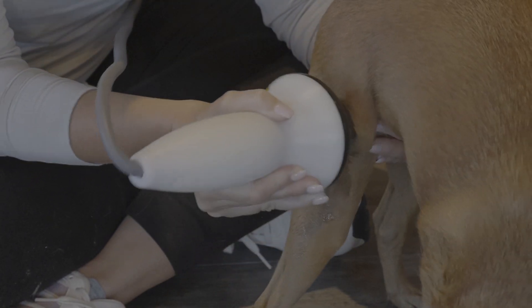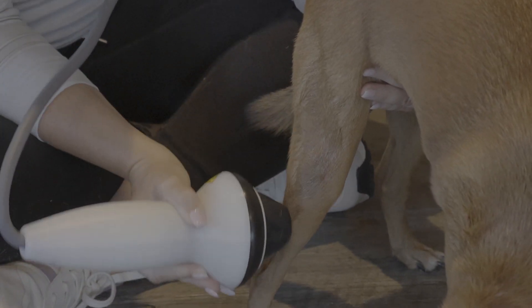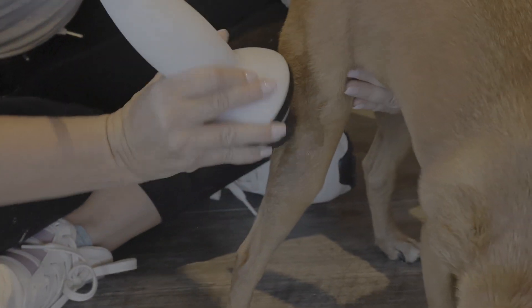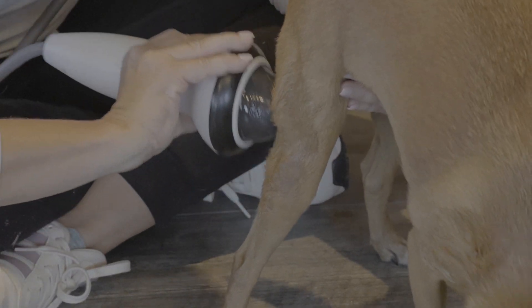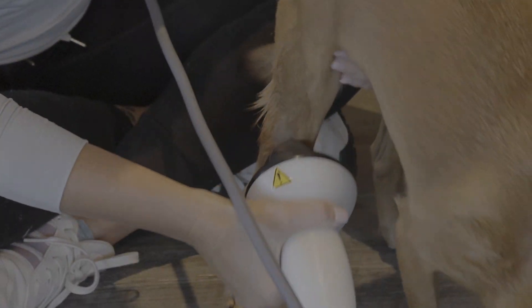So once I've spent a little bit of time up here, I'm going to wave down over the stifle joint and spend a little bit of time on the soft tissues and muscles down here. I'm going to make sure that I even hit a little bit caudally on the knee, slowly moving, and also making sure that I'm hitting the front part.